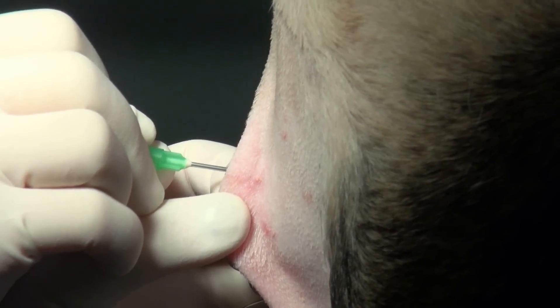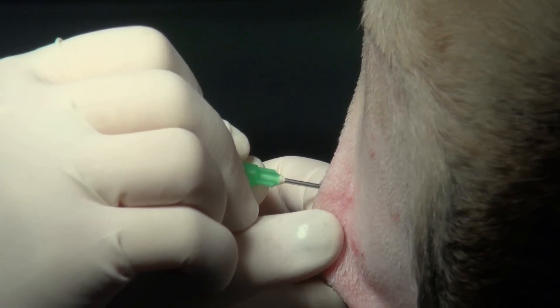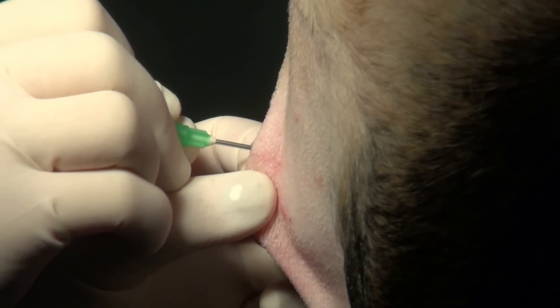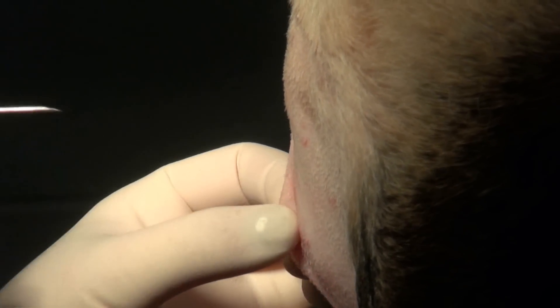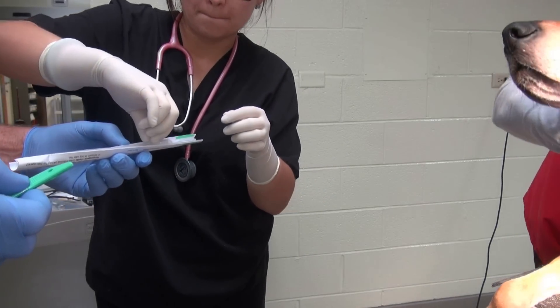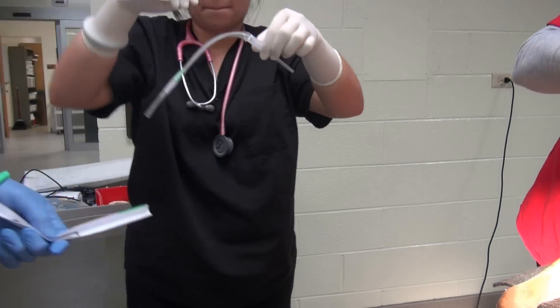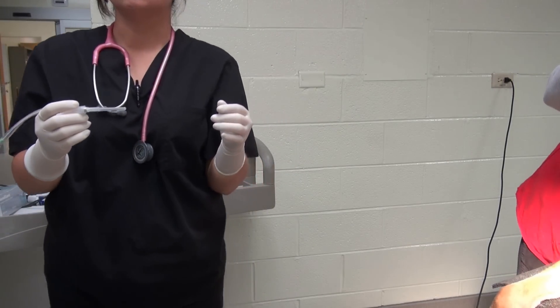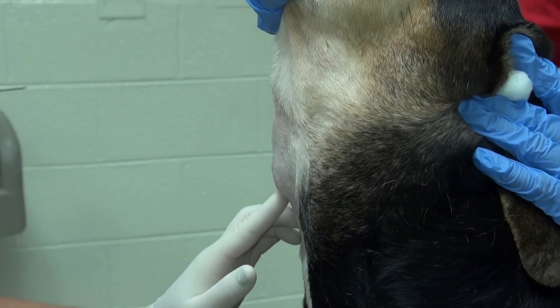Next, use an 18 gauge needle to make a facilitation incision in the skin by injecting directly into the blebbed area, then remove the needle. This small hole will allow us to pass the intravenous catheter more easily through the skin. The catheter is passed to the operator in an aseptic manner and the cover from the needle is removed prior to use.